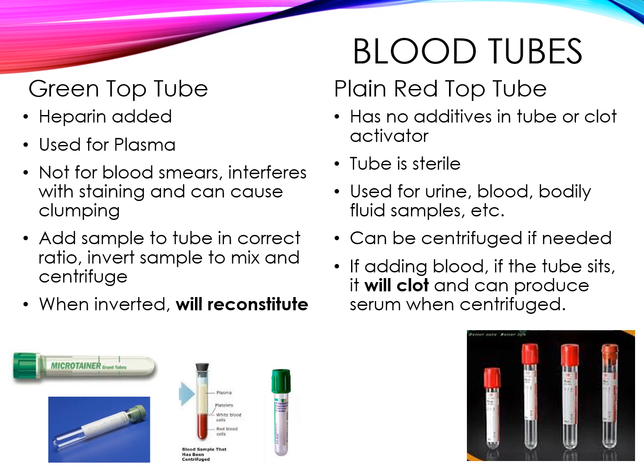These are also sterile tubes. The non-additive tubes can be used for urine, blood, bodily fluid. Again, this is something where you'd want to label what you're putting in there in the non-additive tube. And they can be centrifuged down, and again, this is a tube. If it doesn't have gel, if you mix it or if you invert it, the blood in there is going to mix again. But when you spin it down, you will have serum on top because the blood does clot in these.